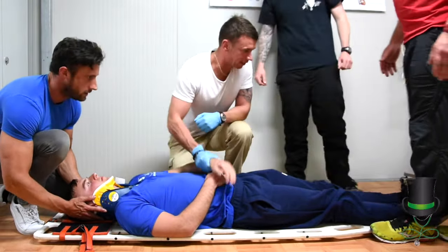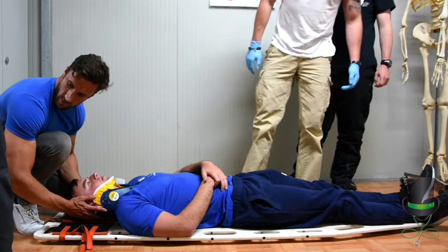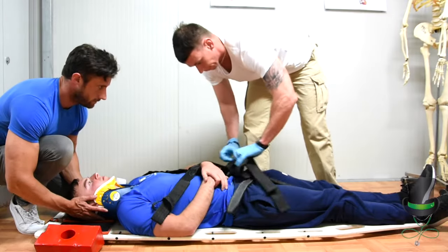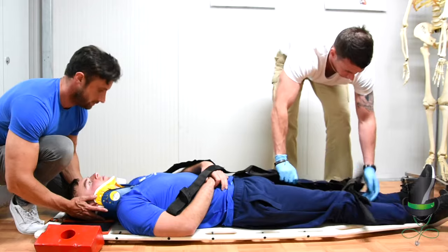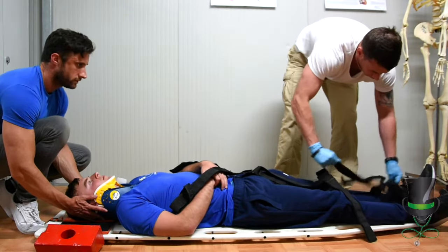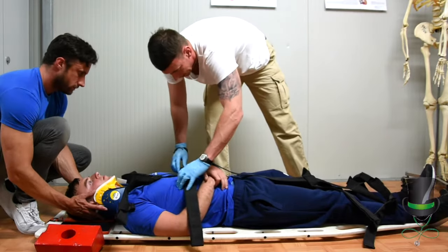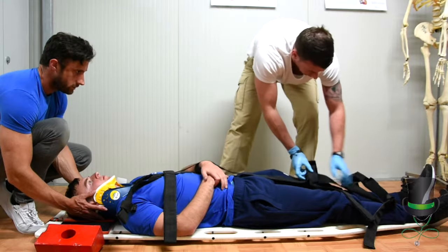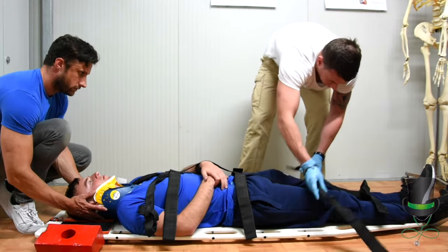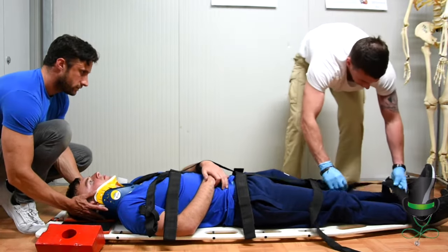Once the patient is centrally aligned, we'll take out our spider straps and strap the patient to the board. The straps will be placed on the patient at the shoulders, the chest, the hips, above the knees — never on the joints — and down at the ankles.